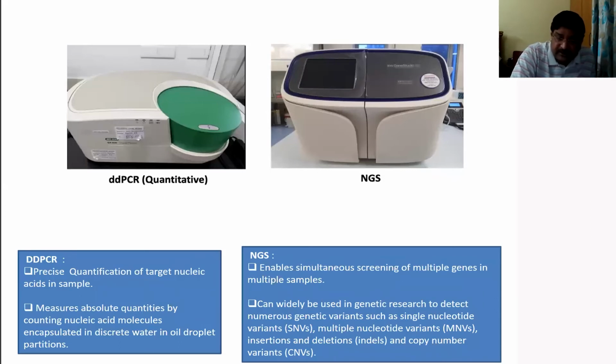It can detect single nucleotide polymorphisms. It can detect multiple nucleotide variants, insertions, deletions, and wonderful copy number variations as well. So this is a platform of the future. So next generation sequencing is the technique which most of the laboratories are going to follow sooner or later. Next.